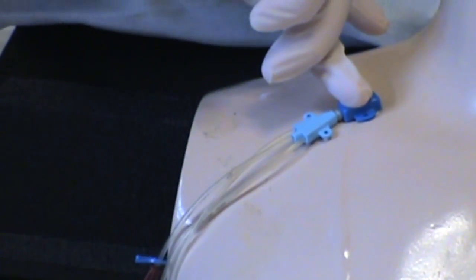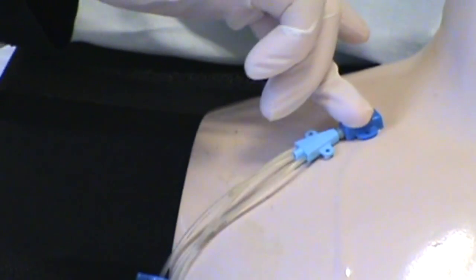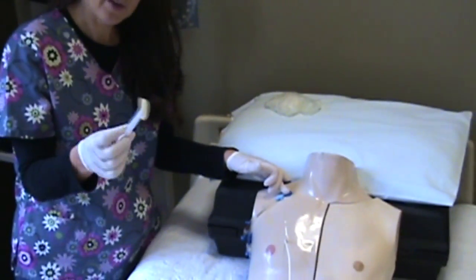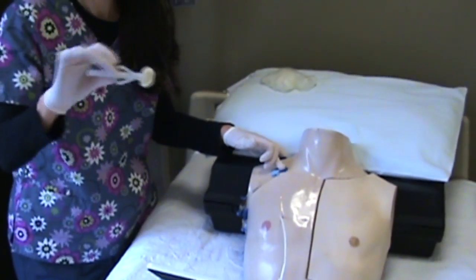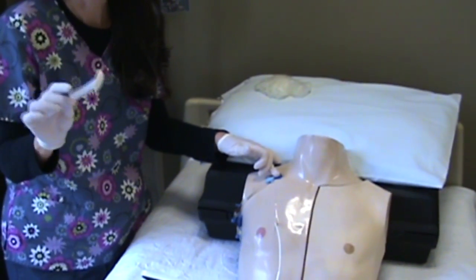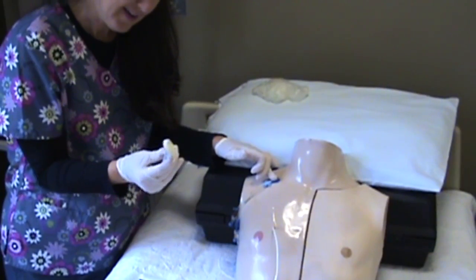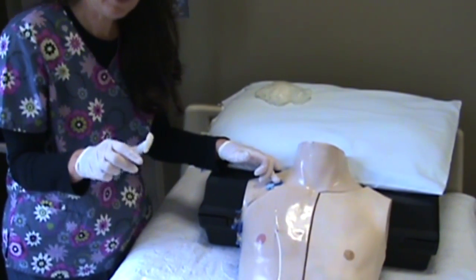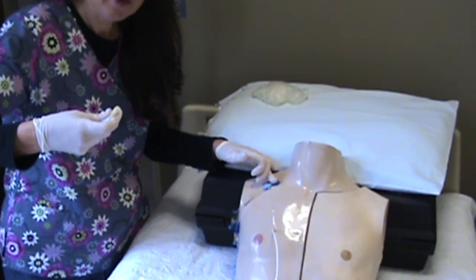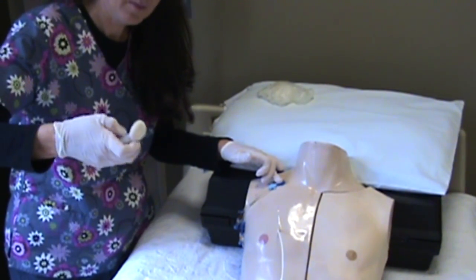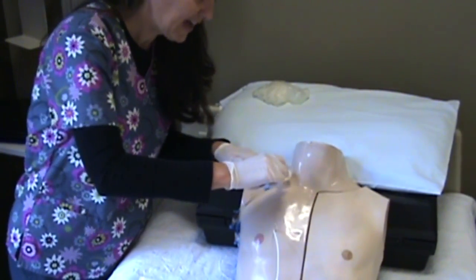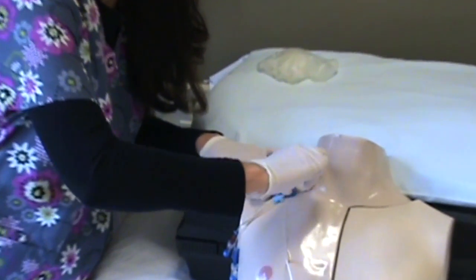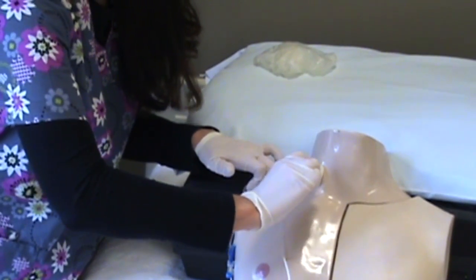Most of your kits don't come with a chloroprep too. Yours is a training kit, so it does, so I'm going to show you how to use the chloroprep. The chloroprep has solution inside. When you get one of these, you take it and you just squeeze it like this. When you squeeze it, it should become soapy and moist in the middle here. Once you get that, you can take it and use it the same as the other: go from inner to outer and just pull it away from the field and go around.